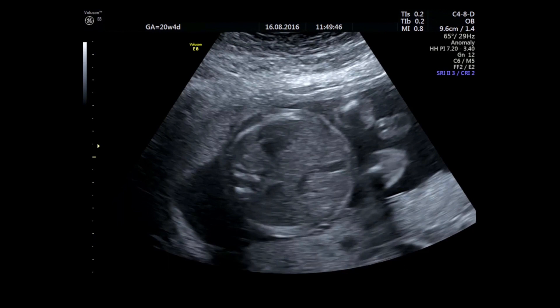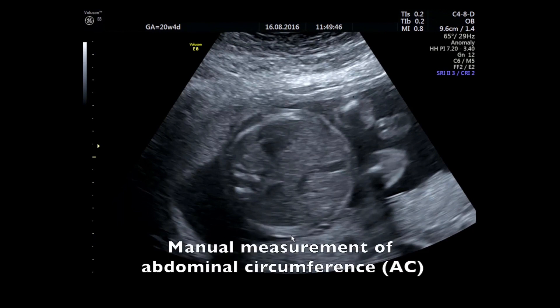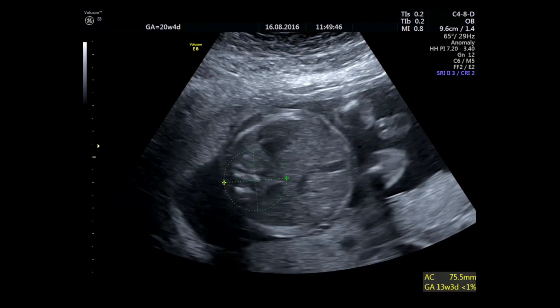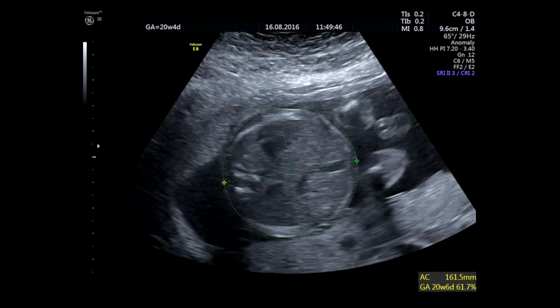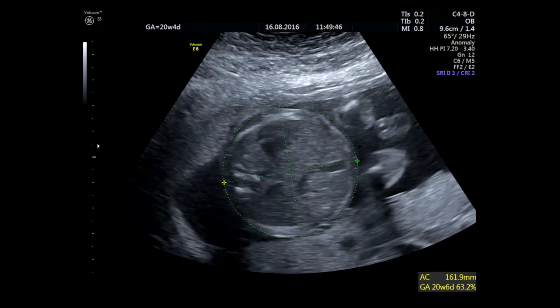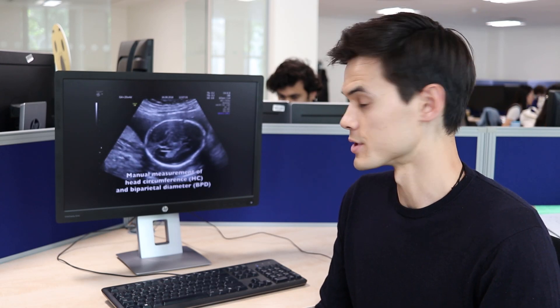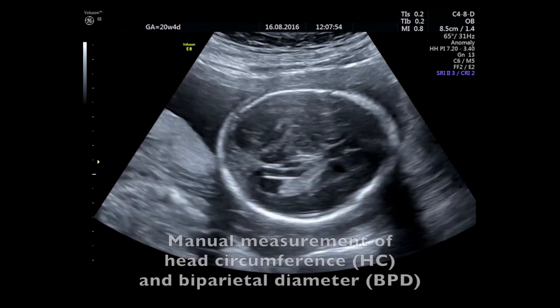The measurement of fetal biometrics is of key importance to monitoring the healthy development of fetuses. This is quite a labor-intensive process that sonographers, who are trained with several years of practice, become adept at. What you can see here in the background is the manual annotation of a fetal abdomen from a 2D ultrasound scan. This process is quite time-consuming and is subject to large inter-observer variability.